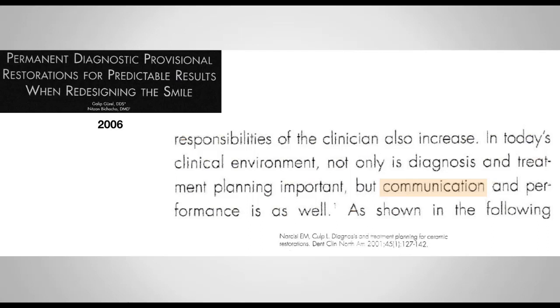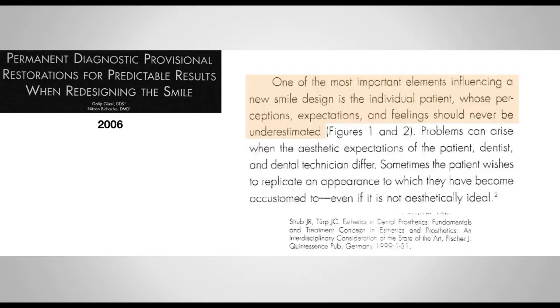Many of us can do a mock-up and have your patient seated on a dental chair, give them a mirror, take some photos, and show them what they should be expecting as a result. But one thing that you will not be able to do is to actually integrate your patient into the decision-making process of such important restorations. Your patient will be able to evaluate them seated in your chair, have some phonetics and a conversation with you. But right before they leave your office, you have to remove the mock-up and you send your patient back home just how they got to your office.